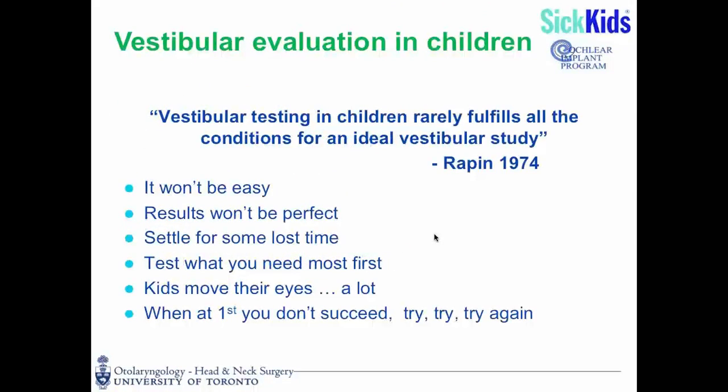This is one of my favorite quotes by Rapin, who has extensive experience testing children. And what she said is that vestibular testing in children rarely fulfills all of the conditions for an ideal vestibular study. And I think we really have to keep that in mind in order to get what it is we need out of this testing.